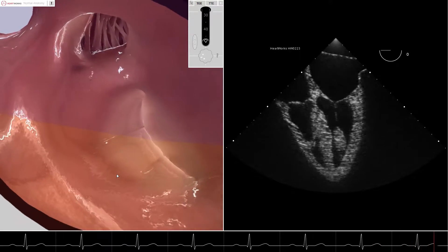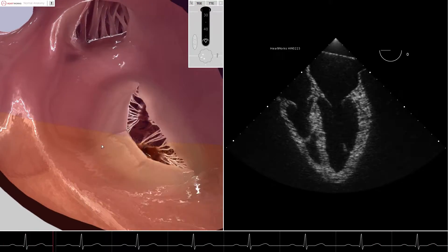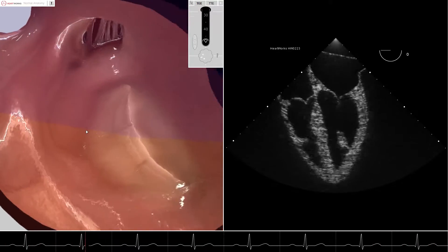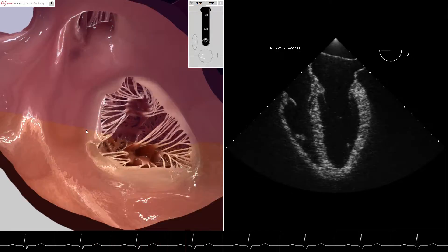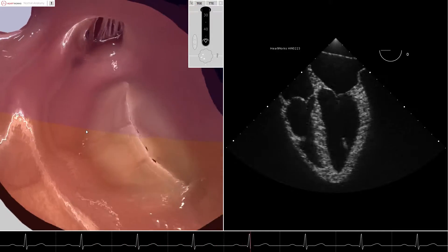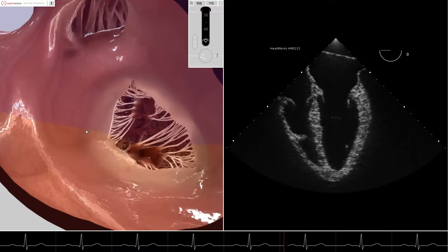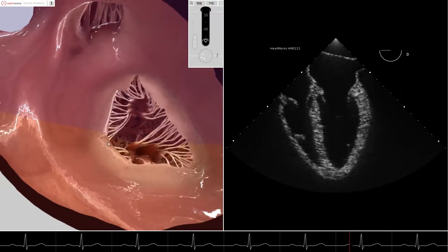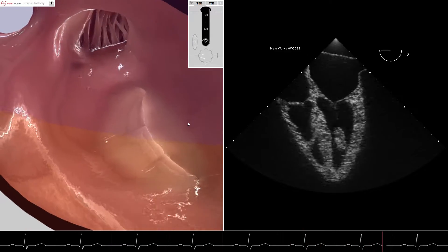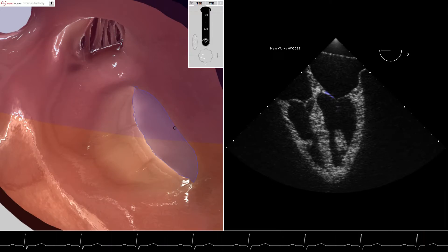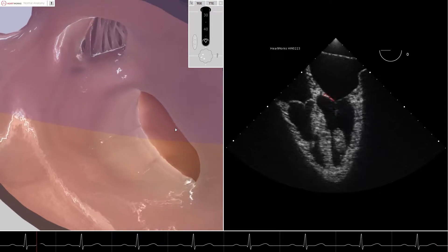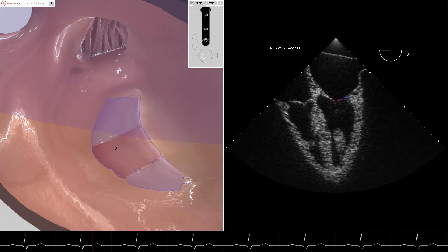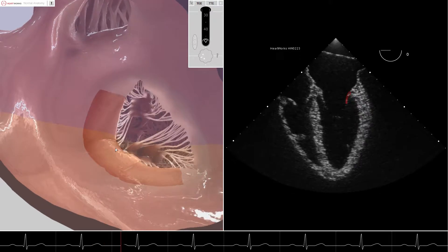The cut plane can be seen in transparent purple on the left image. With the omniplane of the transducer at zero degrees, we can see that the cut plane goes through the anterior mitral valve leaflet and the posterior mitral valve leaflet.